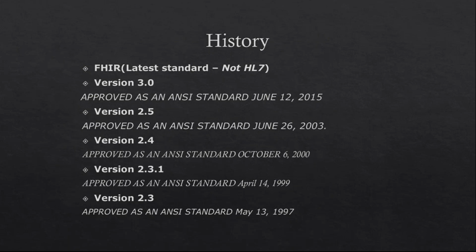So just to quickly look at HL7 history. It has been in industry from the 1980s itself, but the standard emerged in 1997, where the first standard was 2.3, which was approved and vastly accepted by the entire hospital industry. And from then on, we had different versions.